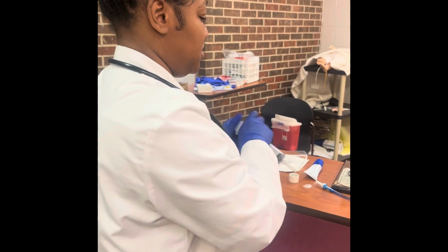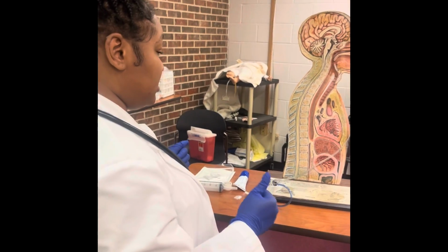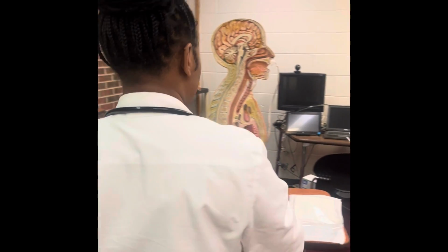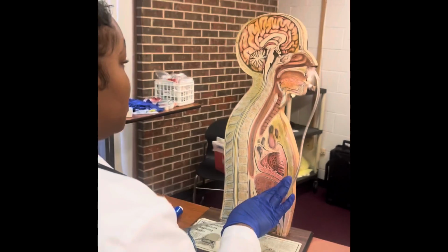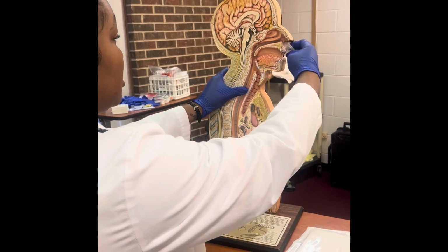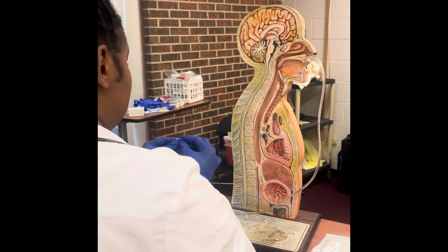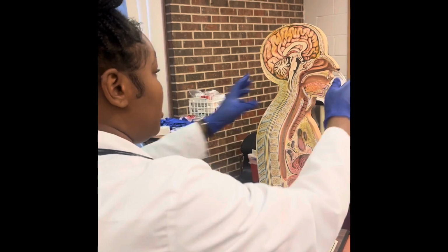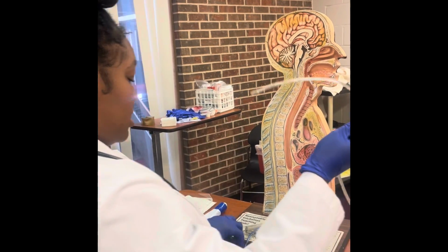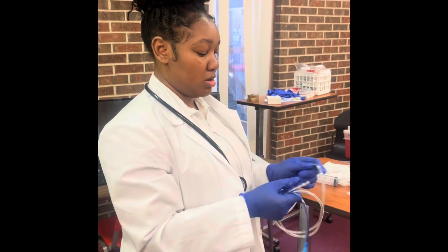And then lastly, I'm going to discontinue his NG tube. So I'll also go ahead and have some paper towels just in case any secretions come out as I'm pulling. All right, Mr. Smith, I'm going to get ready to pull. As I'm pulling, I want you to take a deep breath in. And then when he exhales, I can go ahead and take the tape off. The tape will already be off. And as he exhales, I'm going to pull the NG tube out in one swift, continuous motion. So breathe, breathe, breathe. All right. And discard all my supplies, clean up, and get the patient back comfortable. Thank you.